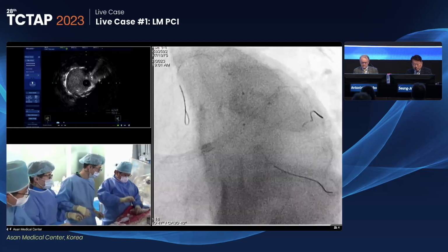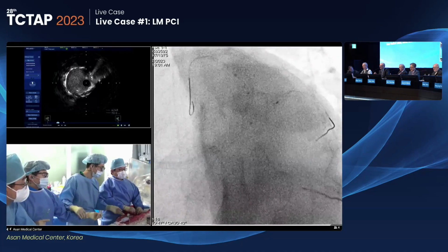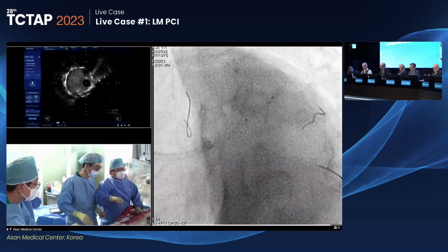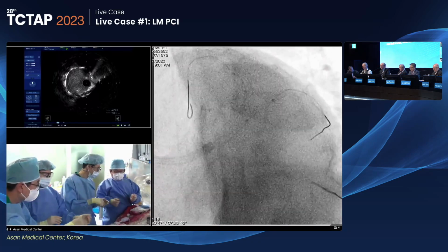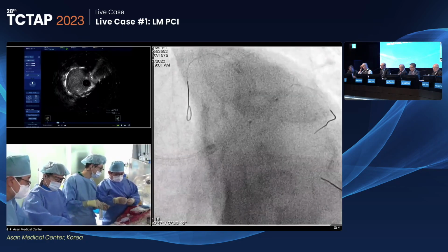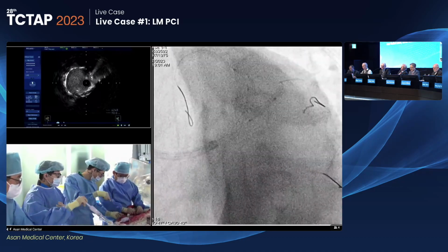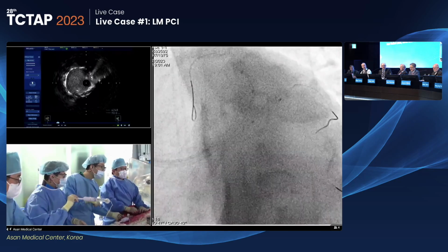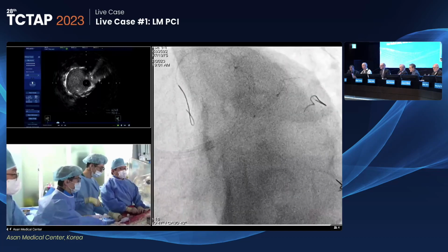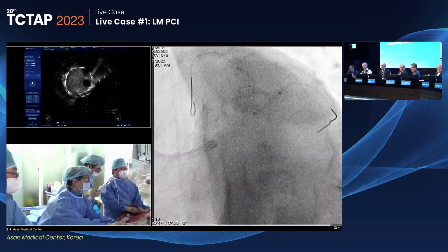I think this phase is very important, having put all these stents in, to make sure that you've put them in properly and to make sure the ostium, particularly of that intermediate, is properly open. It's really important not to stop and say it's done, but to spend some time making sure that you've expanded these stents the best you can. Once you've committed to 3, you really need to make sure that they are all open well, kissing them well, and IVUS them. That's when you invest your time and effort.